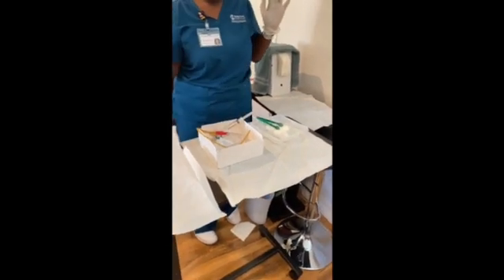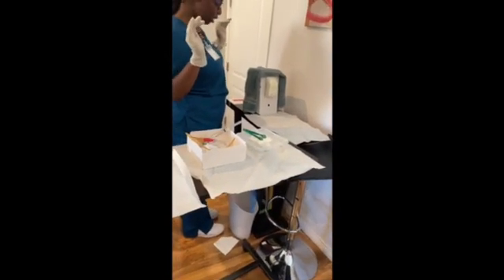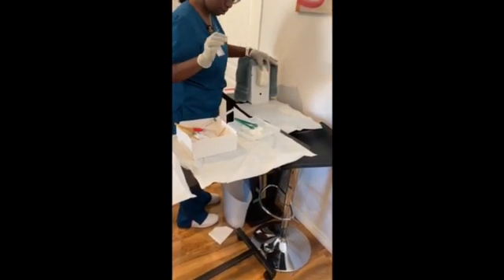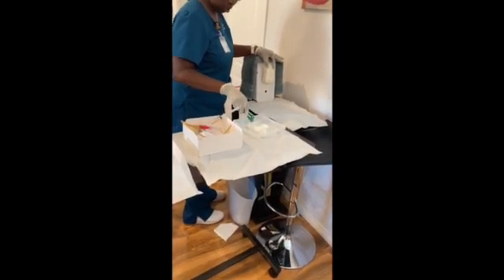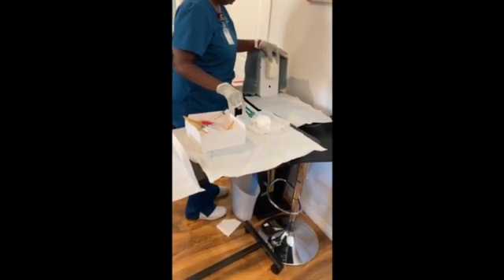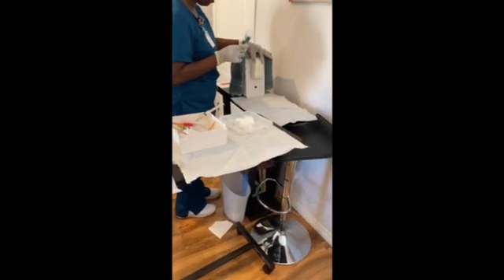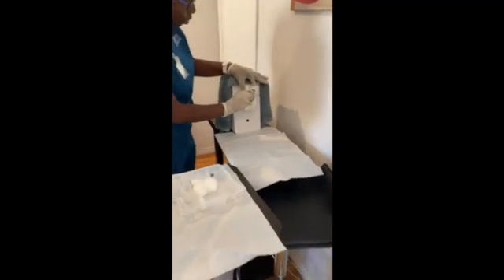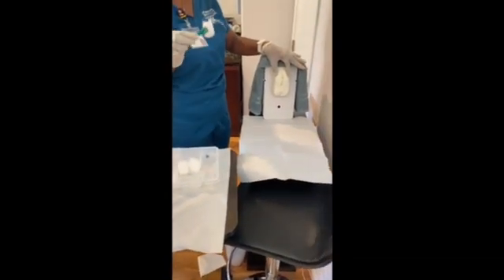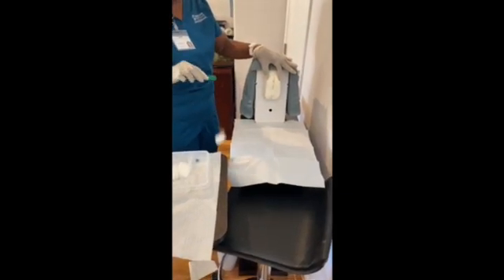If 3 cotton balls are present in the kit, only cleanse the far labia majora, inside near labium, and down center directly over the meatus. So go ahead and hold. From the furthest outer labia, one swipe down, closest outer labia, one swipe down.